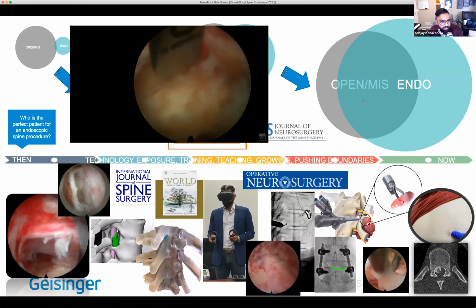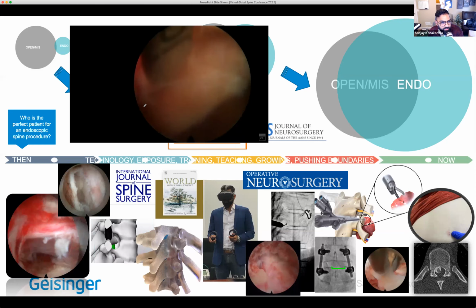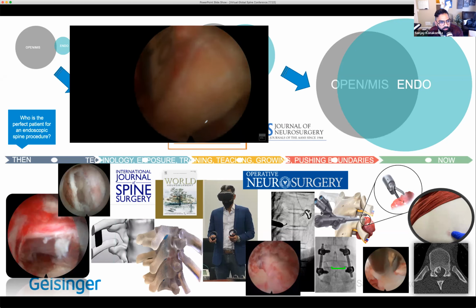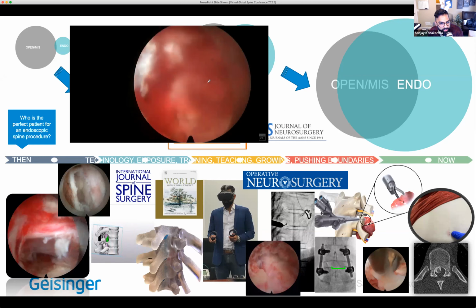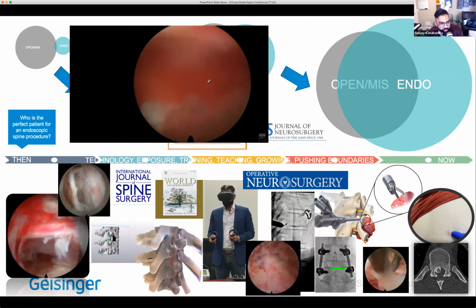And that's us peeling off that last final cortical rim of that large calcified disc there. This is just a dissector that we can put through there, and you can see that dura sort of pulsating after removing that last remaining fragment. That's a view ventral to the dura, and that nice disc space there, remaining portions of that vertebral body on the top.